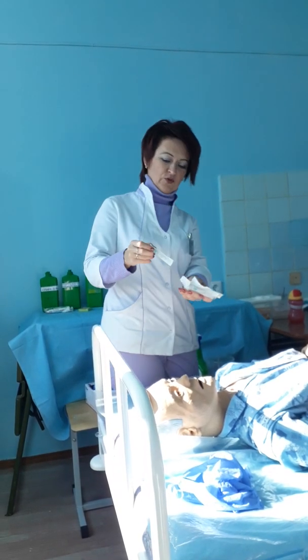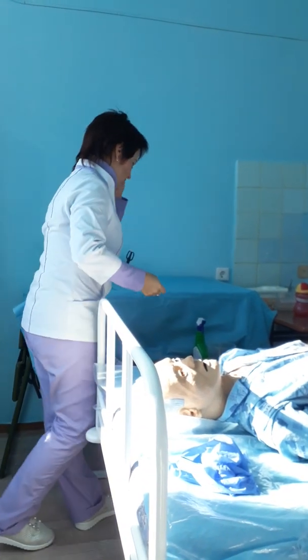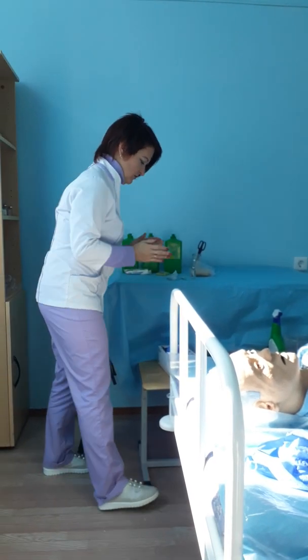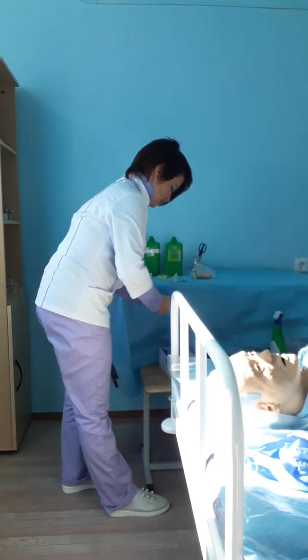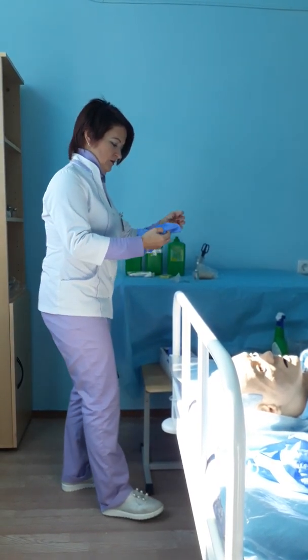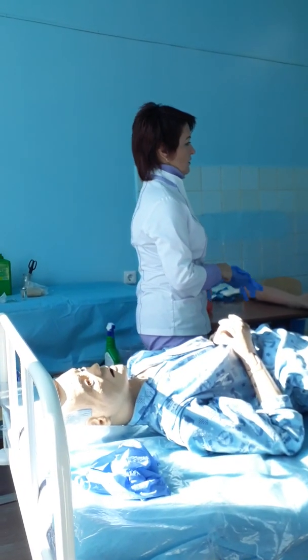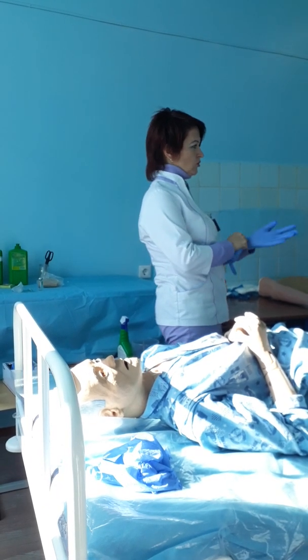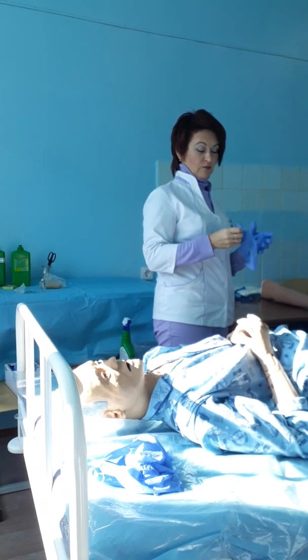You, of course, check the expiry date and integrity of the disposable device. After that, you clean your hands and put on new non-sterile gloves. This is very, very important. For subcutaneous or intramuscular injection, it's not very wrong if you do it without gloves.